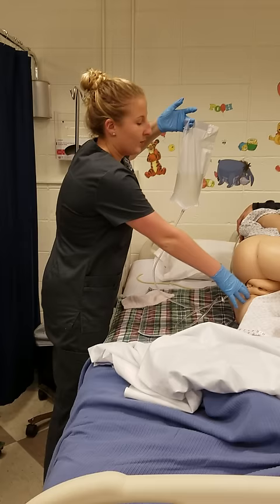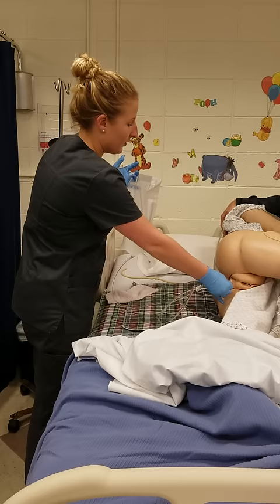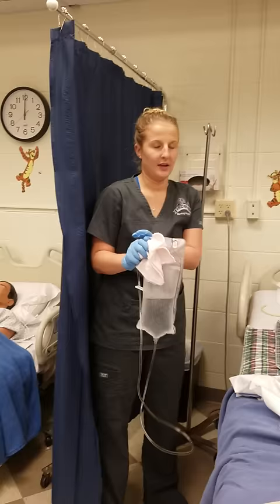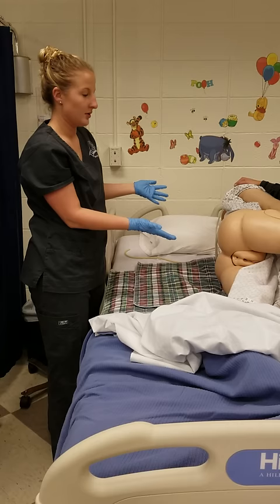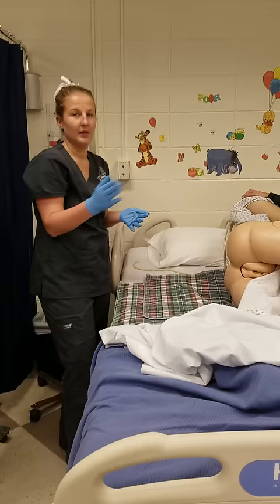Once they were finished or needed it to slow down, I could lower the bag and clamp the tube back off. I would let them know that I'm about to remove the tube, remove it, and place it in a napkin. I could then dispose of it in the trash. I would help them roll back over or stay on their side, whichever was most comfortable. I would have them try to hold it for five to fifteen minutes. If they needed to go right then, I would assist them to the commode. Otherwise, I would give them their call light within reach.